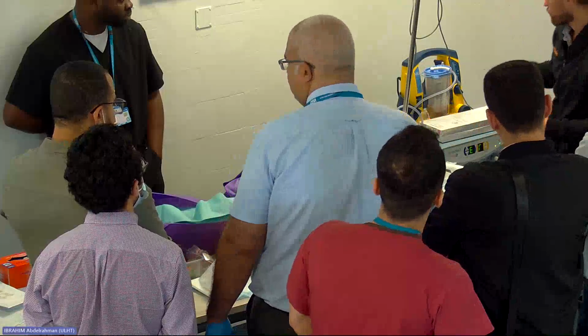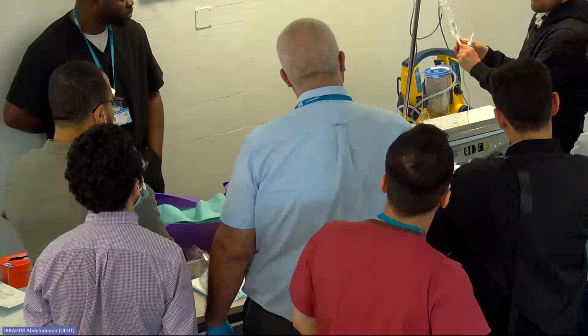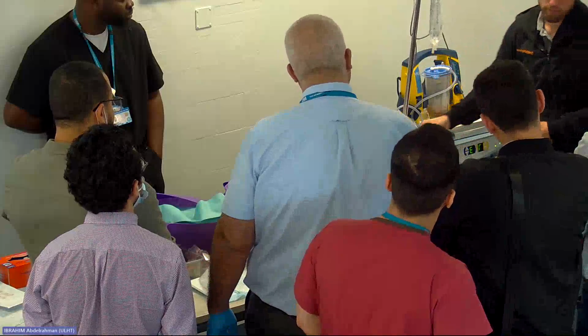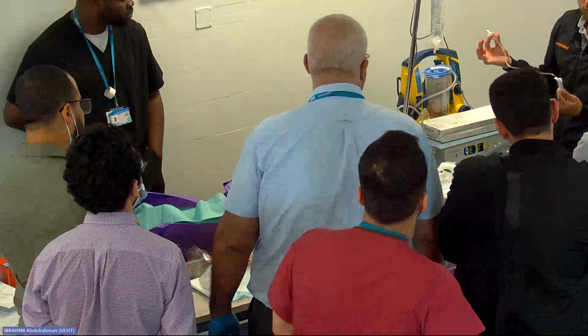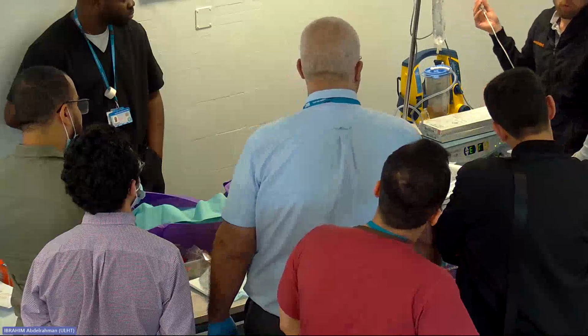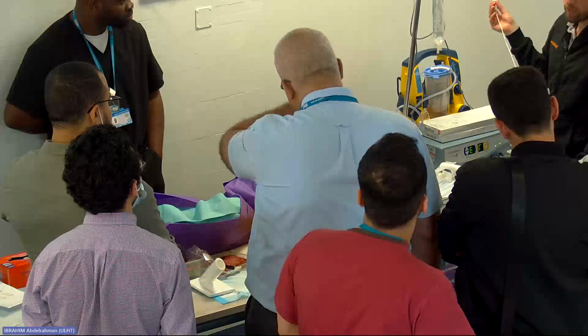The saline will always be at least 3 foot above. It's a gravity fed system, not a pump or anything, so it needs to be as high as possible, really. The saline drip is at least 3 foot above the patient's head. Where you're going to control the flow of saline from, now you can leave this up here if you wish. Some people do, or you can roll it all the way down to whoever's scrubbing for them to control it, or for you to control it if you want.